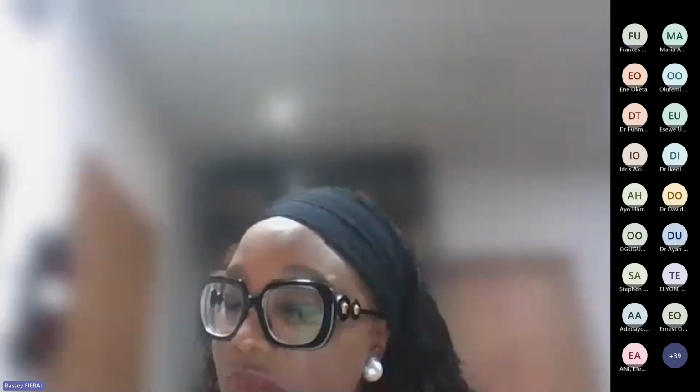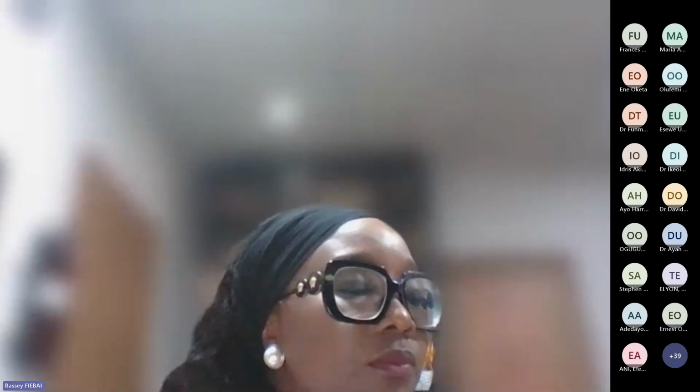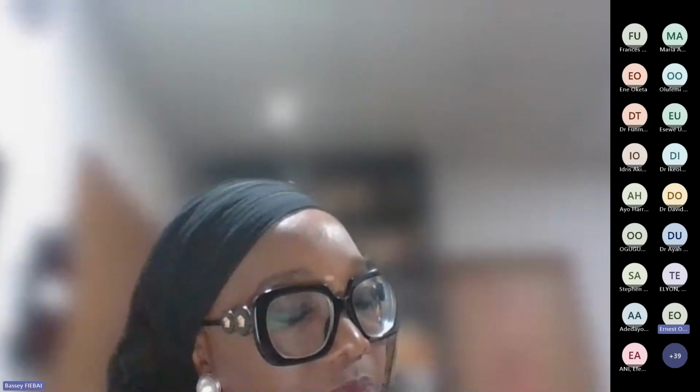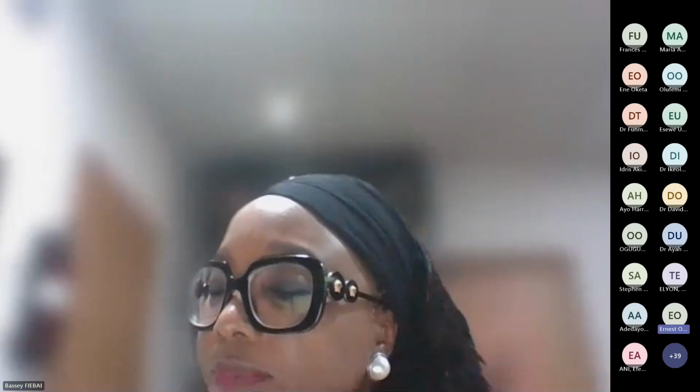Thank you very much, Professor Fibai, for the wonderful lecture. Further to the challenges somebody asked about scanning: one of the problems, especially if you are practicing in a public institution, is that the radiologists are the ones doing the scan. Recently we found out that they don't even bring the pictures. But even the pictures, it is better advised that when you are doing a B-scan, you see it live, and that the kinetic motions are very important.